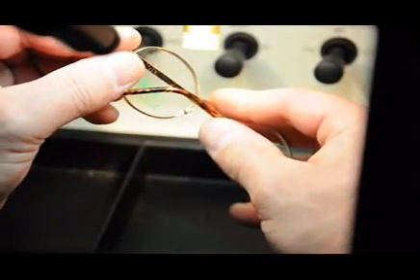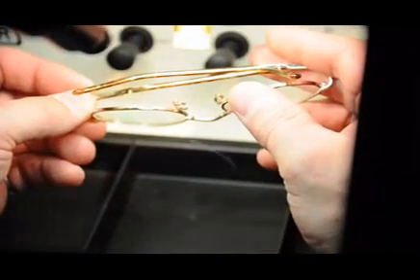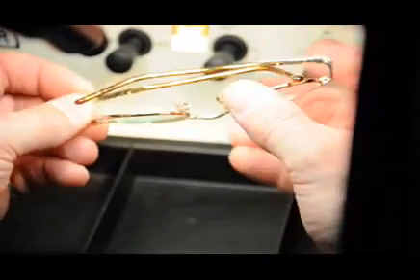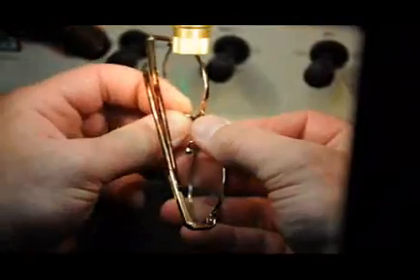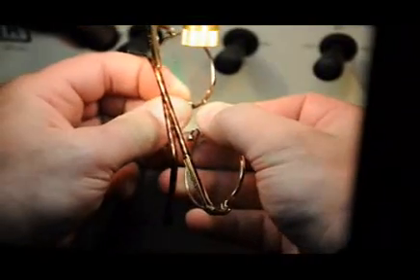Once he feels that the assembly is finished, he will perform one more strength test on the welded arm to ensure that it is a good hold and the repair is complete.